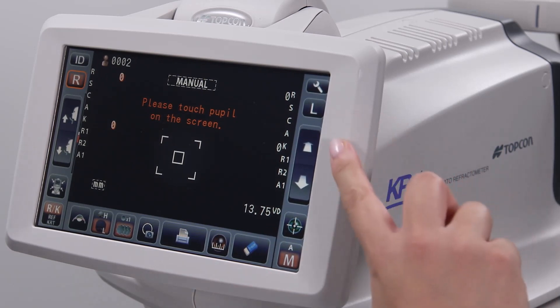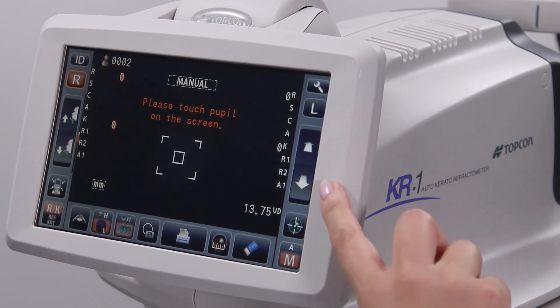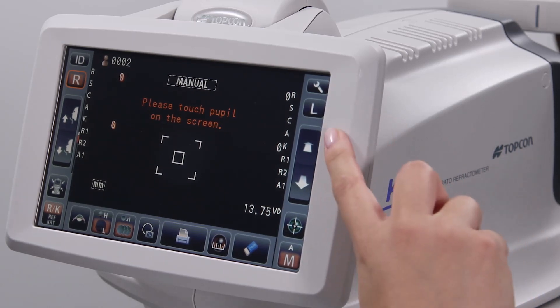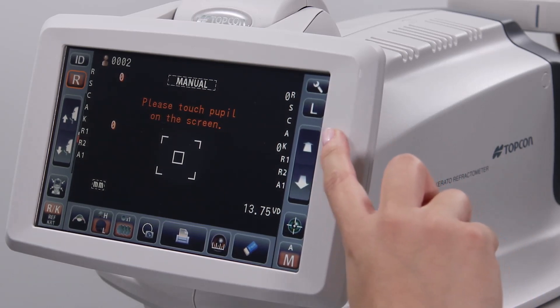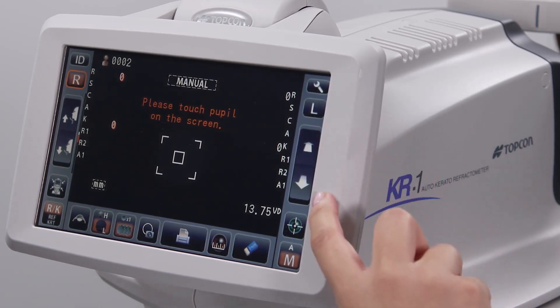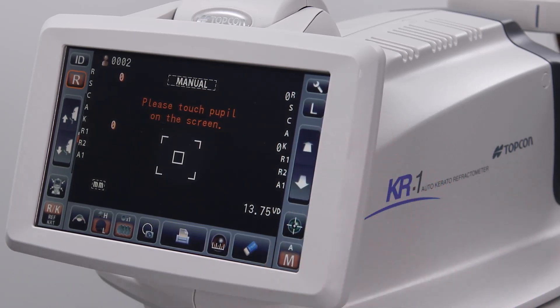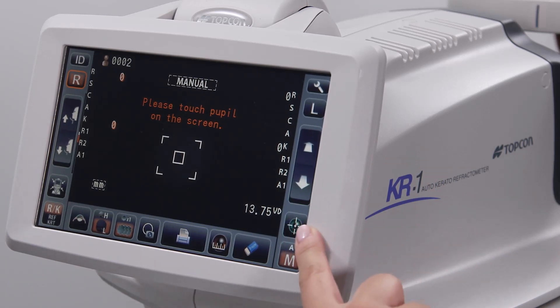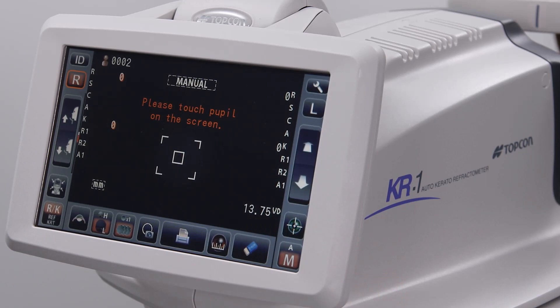The forward and back buttons move the device closer to or further from the patient in order to focus the eye once the pupil has been centered. The capture icon begins data capture when in manual mode, once the eye has been centered and aligned.